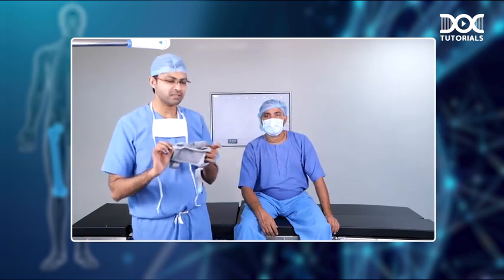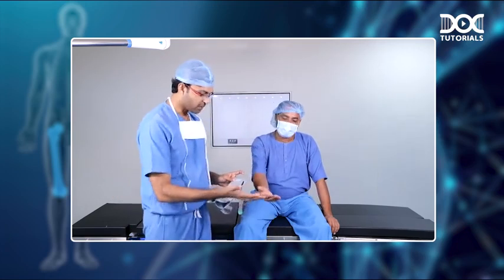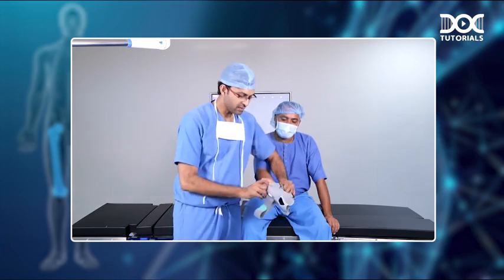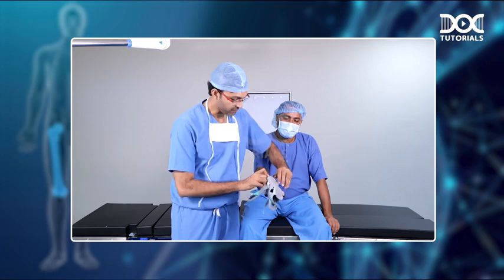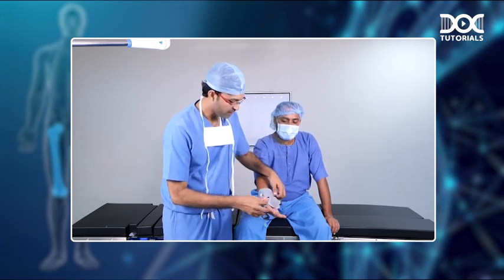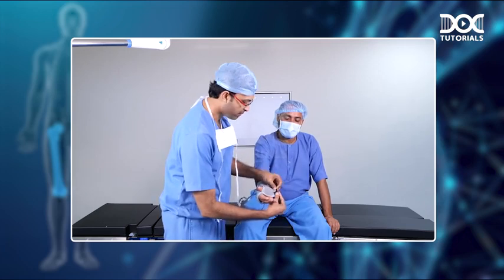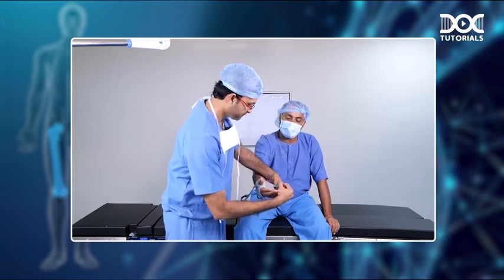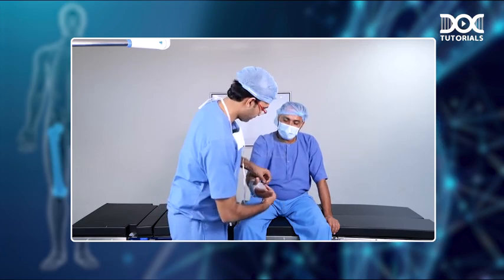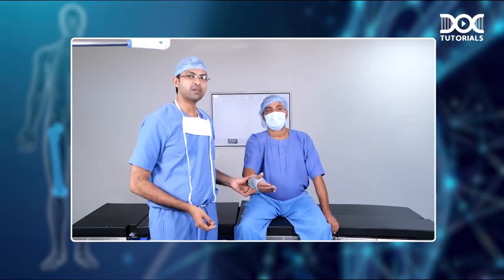How do you apply this? This is a very simple device. So you ask the patient to keep the hand out like this, and you slip it inside. Slip the wrist immobilizer inside like this, and ask the patient to take the thumb out this way. Now you have all the straps here which you can readily apply. So this is your wrist immobilizer.